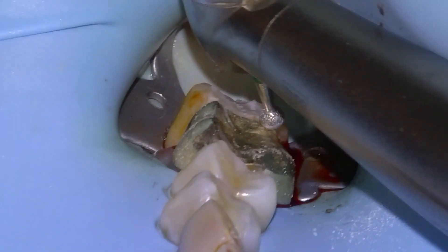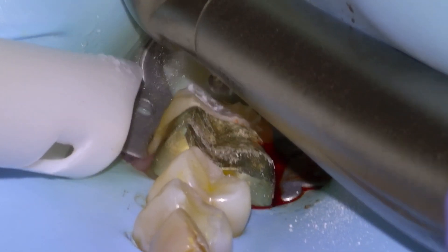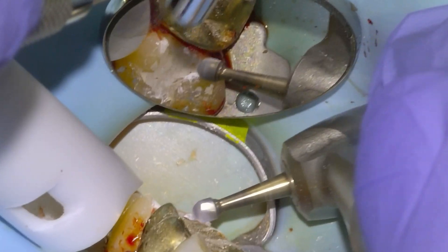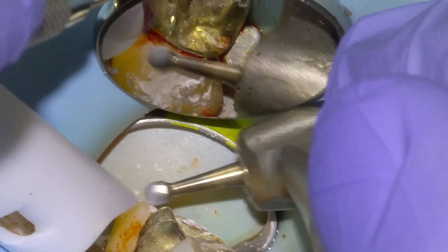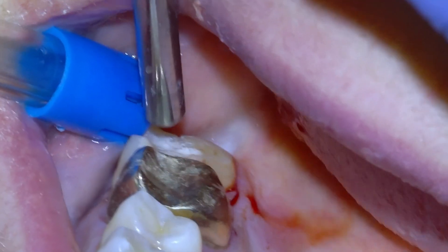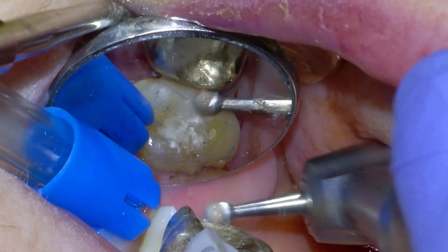The stuff sets pretty hard, but it's nice after about five minutes or so because it still removes pretty easily. The other advantage is that you can really see the margins because the material dries out when you take a slow speed to it. So we'll just take it down approximately anatomically before we check the bite, using some thick articulating paper to take down any high spots.